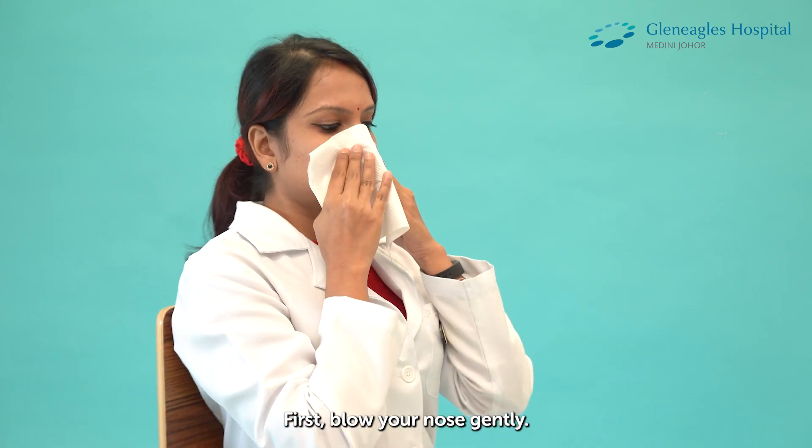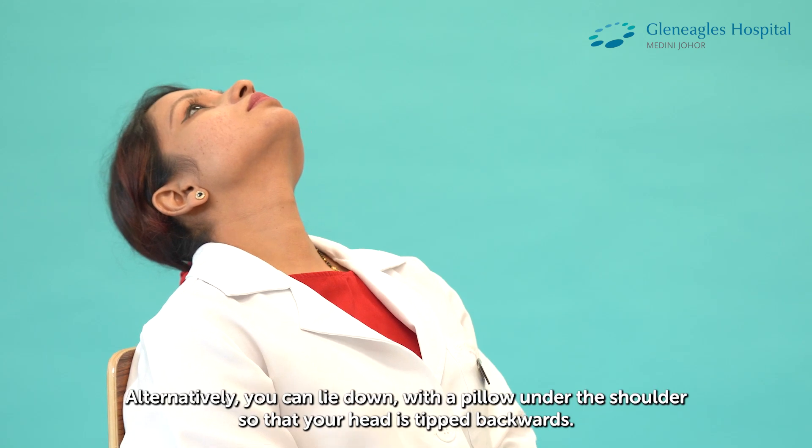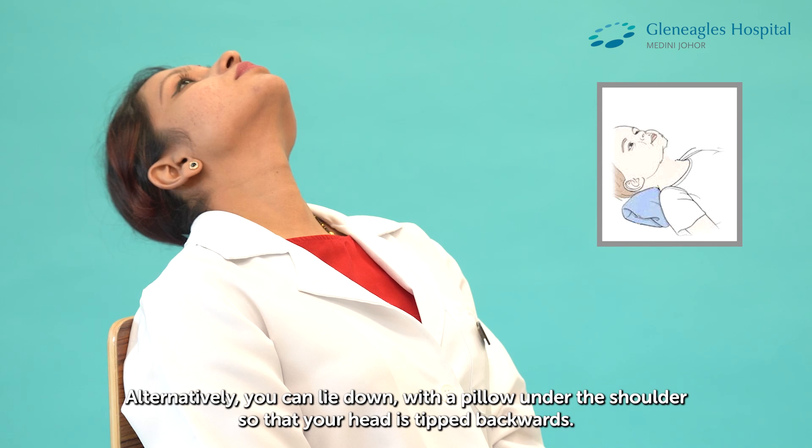First, blow your nose gently. Sit with your head tilted backwards. Alternatively, you can lie down with a pillow under the shoulder so that your head is tipped backwards.